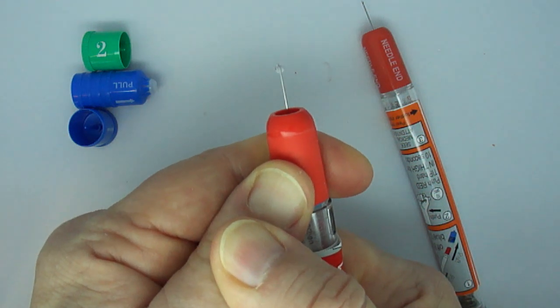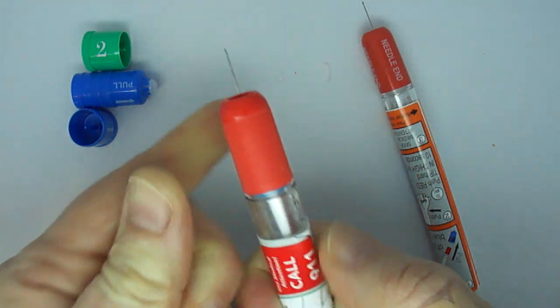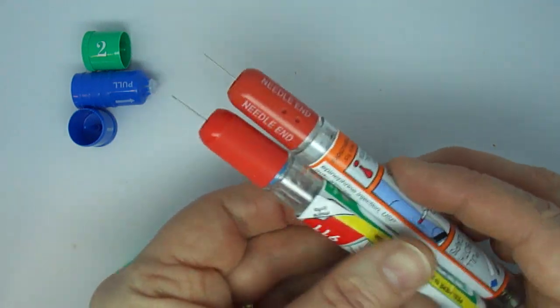One, two, three, four, five, six, seven, eight, nine, ten. Very similar. You can see they look similar as and after they fire. But here is a striking difference.